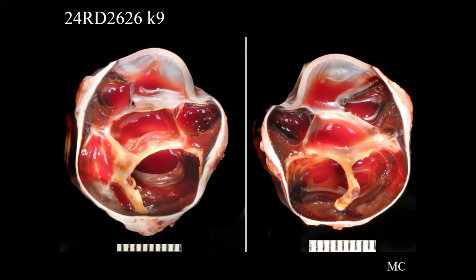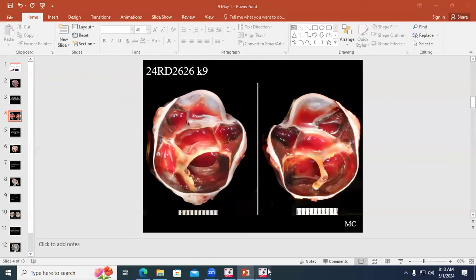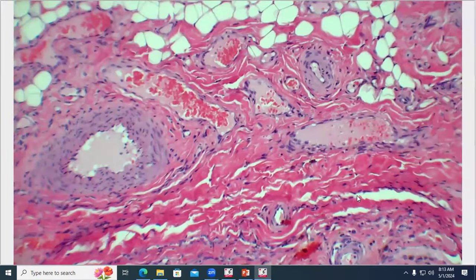Other things that are of interest in this eye, we have a posterior synechia with the iris leaflets thin and billowing forward, so consistent with an iris bombe, at least grossly. We have this, which is the lens capsule, but there are no appreciable lens fibers to be seen. It is indeed filled with blood, at least in our view. And we already mentioned the retinal detachment, so these are the main findings to see grossly, pretty grossly impressive. And it's also cool histologically. Cool to examine as an enucleated globe, to specify.